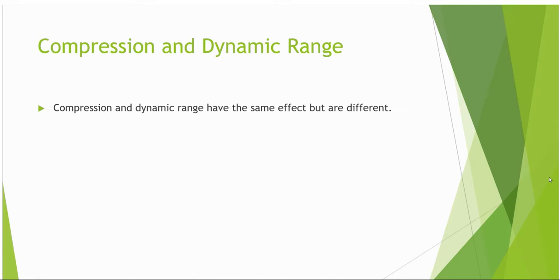As a general rule of thumb, the compression goes down in a technically difficult patient to help delineate what may be a blood vessel or a thrombus against the noise of what is usually a higher gain setting for these patients. High quality imaging affords higher settings and a smoother image, which can improve contrast resolution significantly. Do consider, however, that if compression is adjusted, then gain may also need to be tweaked along with it.